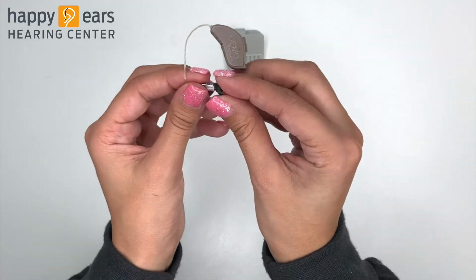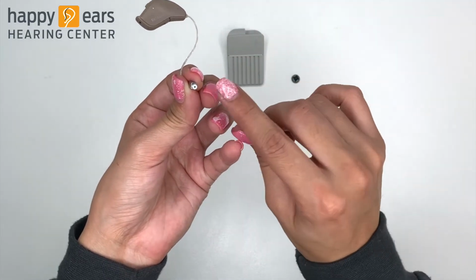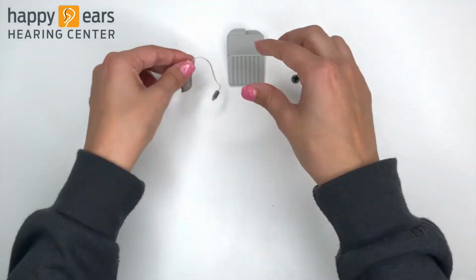Remove the dome from the tip of the receiver. And inside the receiver is the wax filter, which is the white piece that we are going to replace.